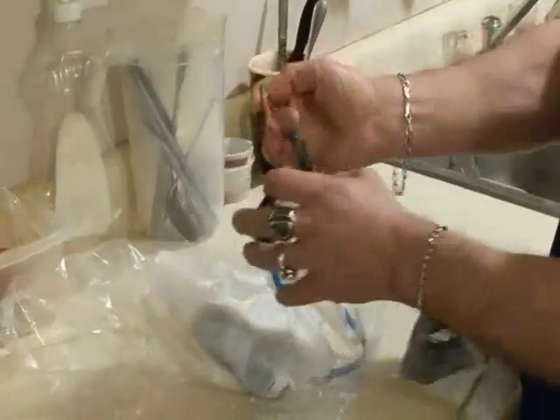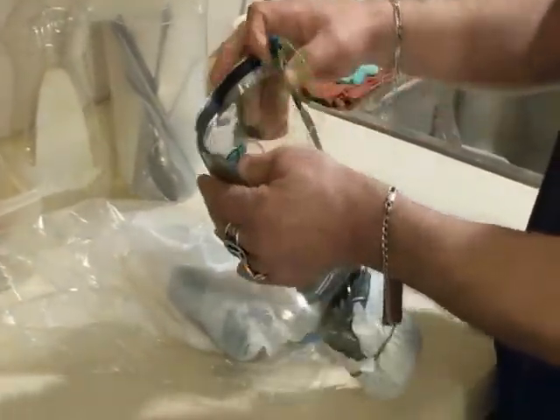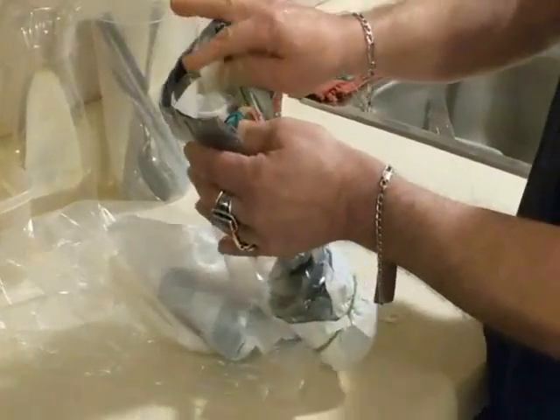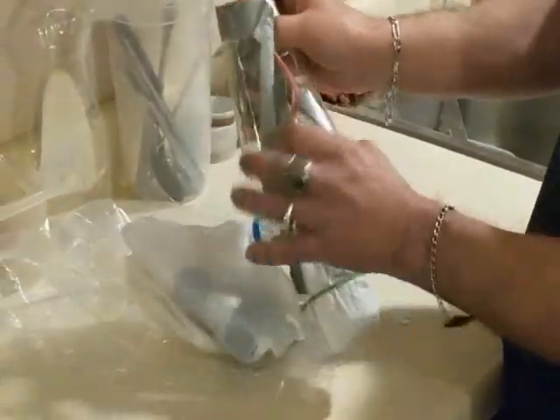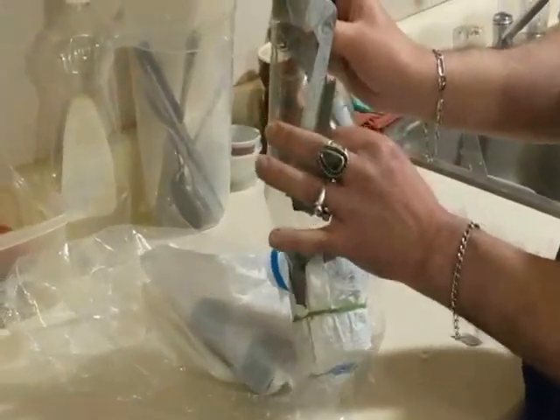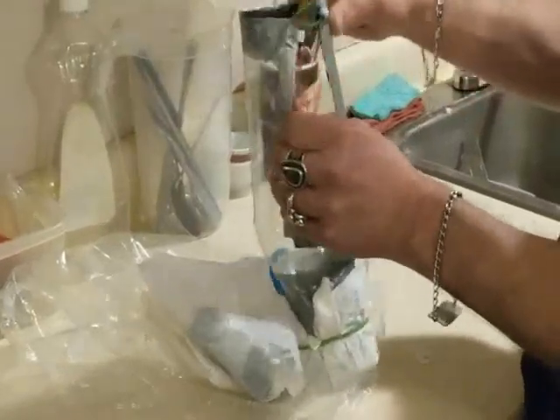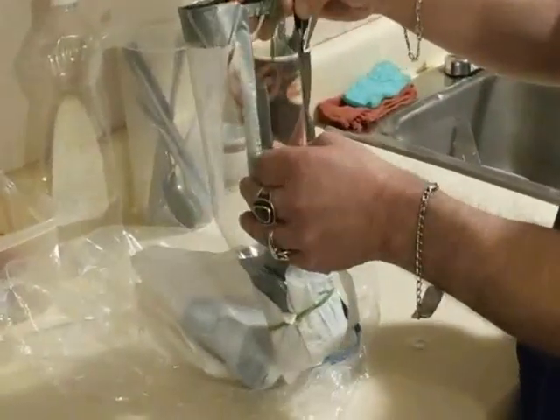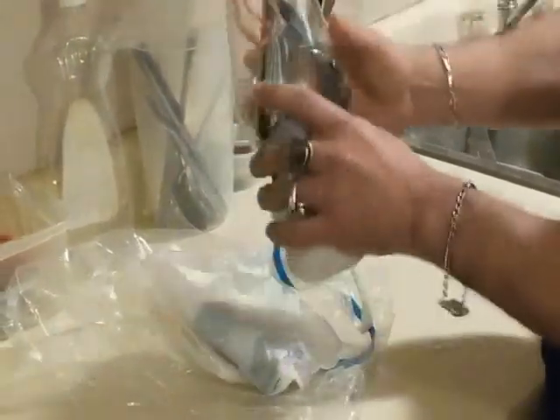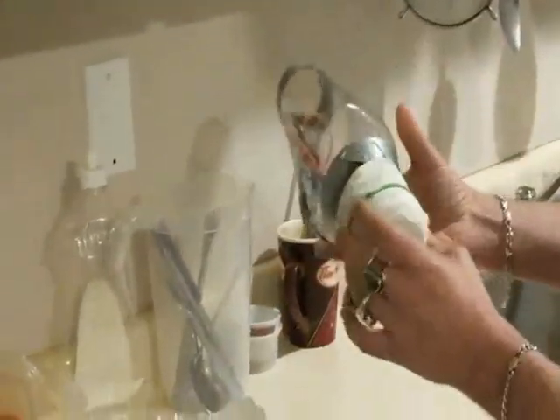The elastic band right there, you've got to make sure that it's not going to be too tight around your head. And I actually put foam tape around the top and around the sides for comfort. That way you don't scratch your face, and it'll be a lot more snug on your face, and that way nothing will get in. We will talk about the bag later.